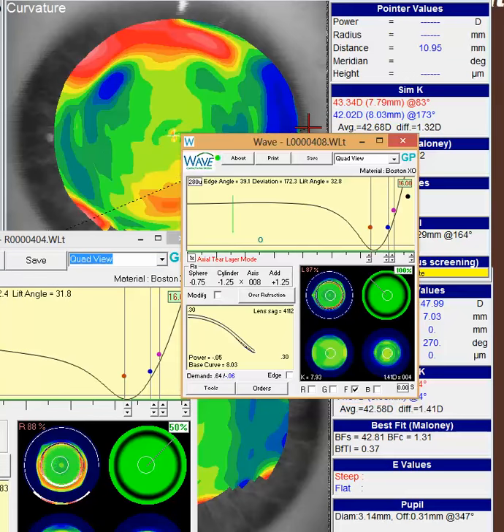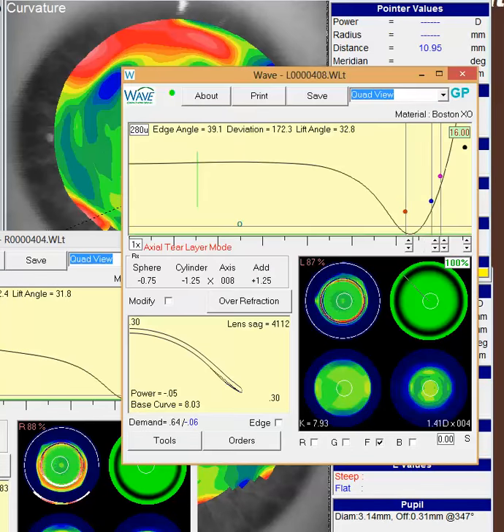Same thing on the left eye. The design actually looks really good based on your topography and everything. With this one here, if it seems a little steep, a little tight in those areas, either you can just flatten out the edge angles there to get a little more limbal clearance.